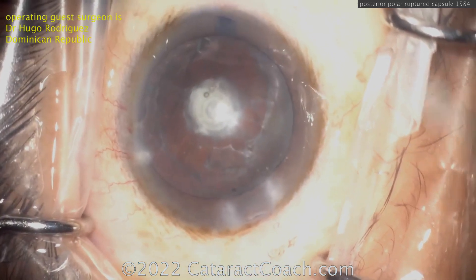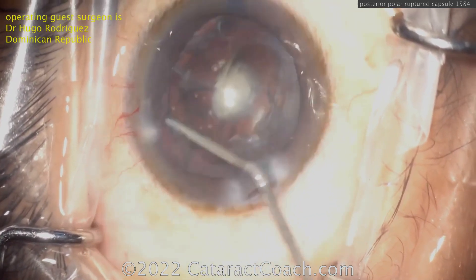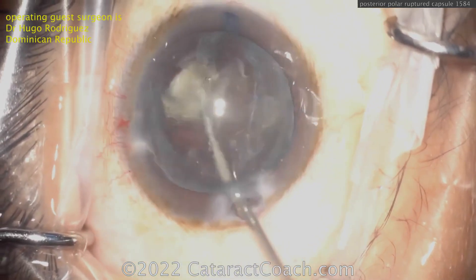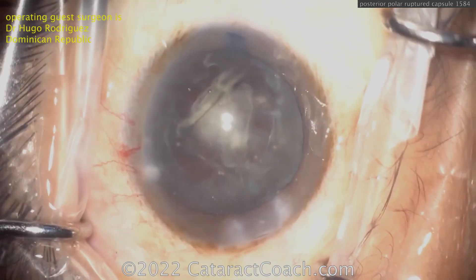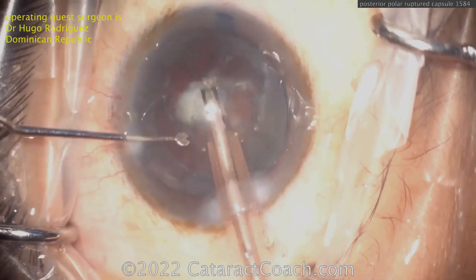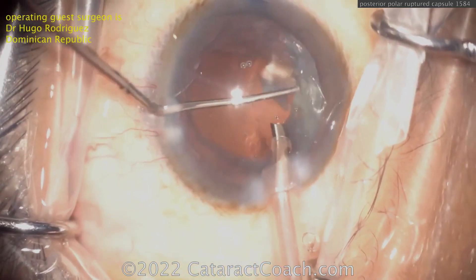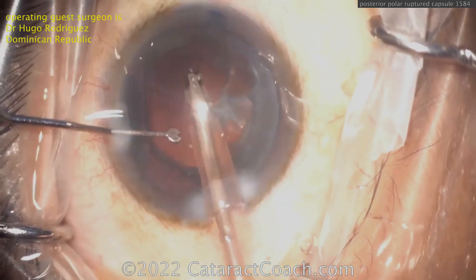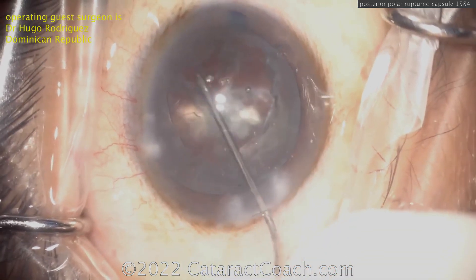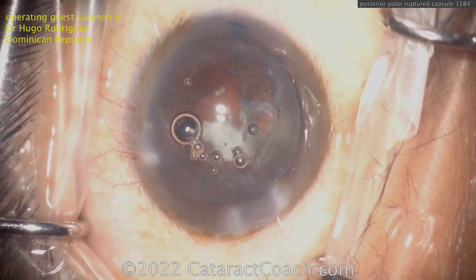The epinuclear shell is out, and now here comes viscoassist — viscodissection — doing everything exactly the right way. You're able to really get that remaining epinuclear shell and cortex out of the bag, beautifully done. Going inside to aspirate it, and once that's done — boom — we've got an open posterior capsule. Not the fault of the surgeon; this is patient tissue. Even if I or any other master surgeon did this case, you'd have the same issue. Now you can see a little piece of nucleus or epinuclear shell or cortex that has fallen back slightly, and he's getting that piece up.